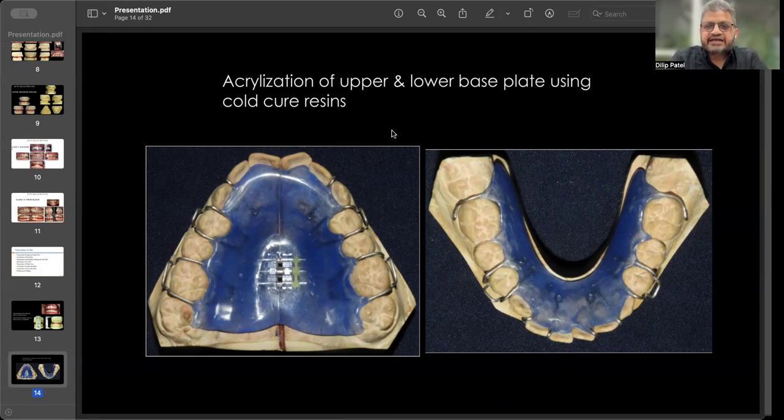As you extend the lower plate up to the last erupted molar, it holds the mandible properly, and you can control the flaring of the lower incisor because of the forward force from the lateral pterygoid muscle on the mandible. And the upper bite plate is also extended up to the last molar, and the midline screw should be placed.